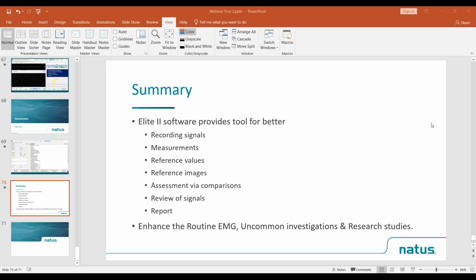Usually we like to get a sharp rise time. That has been the convention, but sometimes in patients with neuropathy or motor neuron disease, you may not get a short rise time. They have reinnervated motor units, so they will have a high rise time. So that is just a kind of quality assurance that I'm inside the muscle that I'm trying to test and I'm close to the motor units. It doesn't give us any information about pathology.